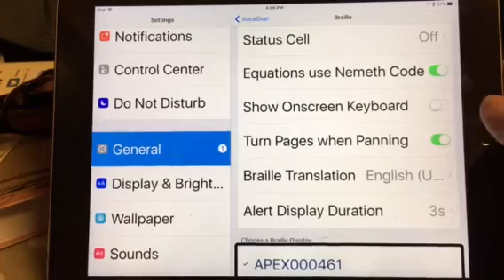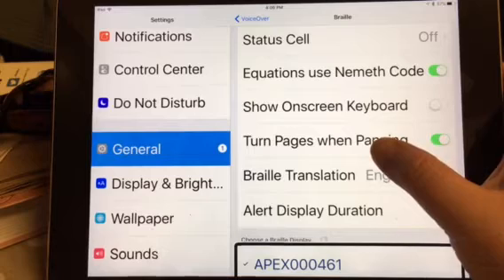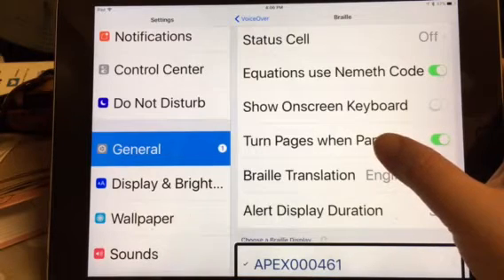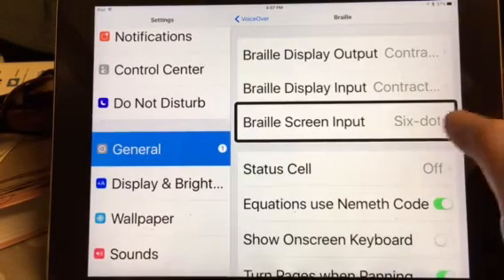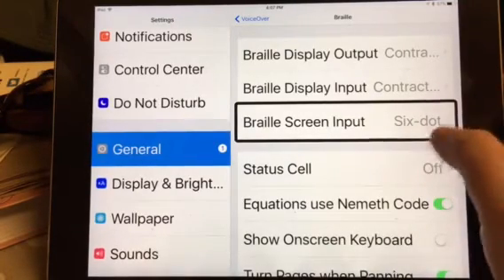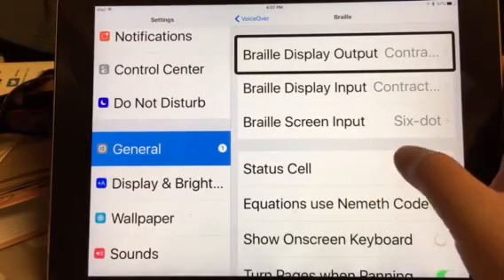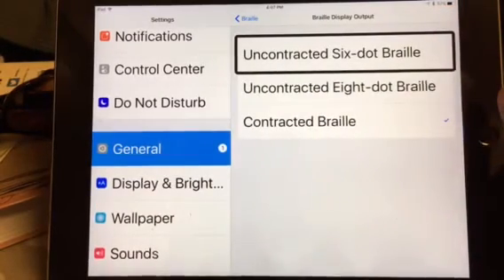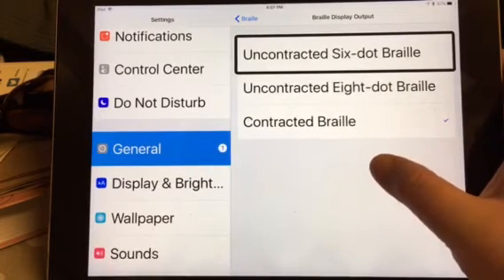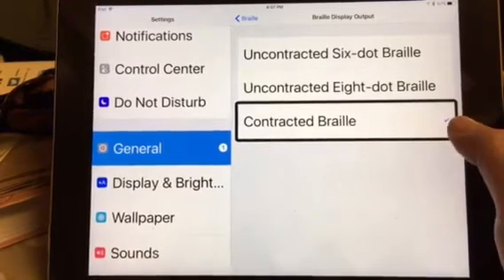So now I'm going to show you how you can change the Braille to uncontracted, contracted, six dots, or eight dots through your iPad. If you go up to the very top of the screen to the Braille display output and double tap on it, right now it's uncontracted six dot Braille, uncontracted eight dot Braille, or contracted Braille.